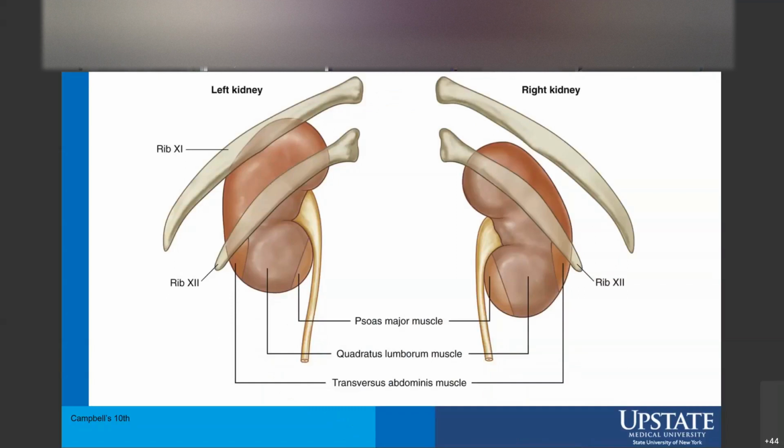And so when you're approaching a kidney for access, you want to think about which side you're on and take a look at the CT scan, assess where the pleura is, assess where the liver is, the spleen, colon. It's not uncommon for patients who require PCNL to be wheelchair bound, contracted. Patients with severe neurologic illnesses like MS may have very collapsed lung volumes. Their kidneys may be quite high in their chest.